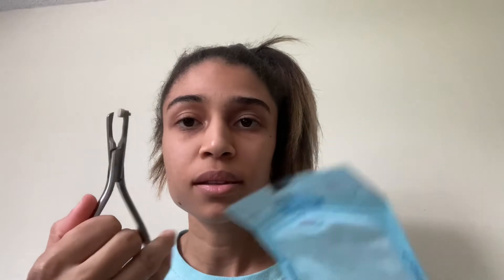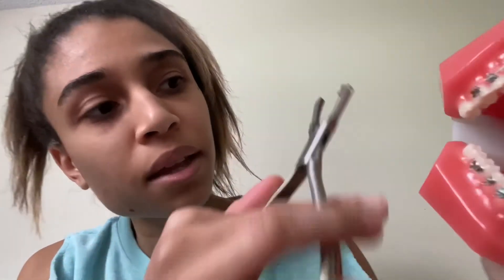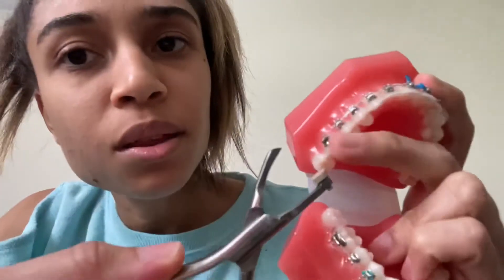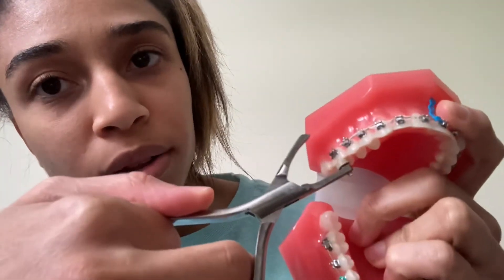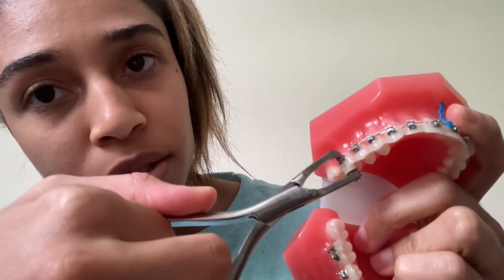Band remover. This is to basically remove the bands — simple. These little bumpers are replaceable and it could have plastic or ceramic. Pretend this is the band — this end is going to go on the occlusal surface and you're going to remove the band just like that.